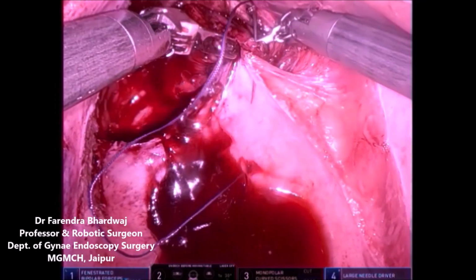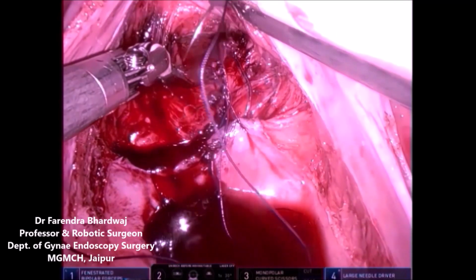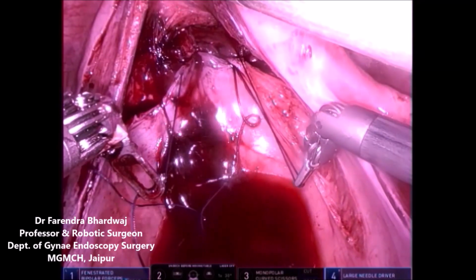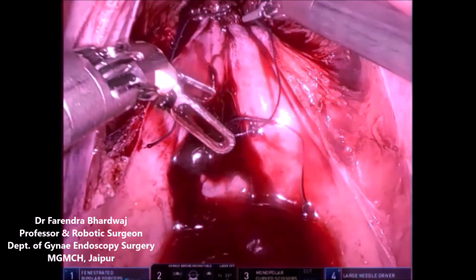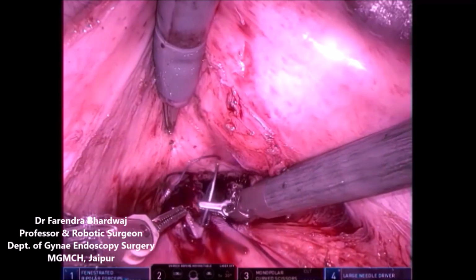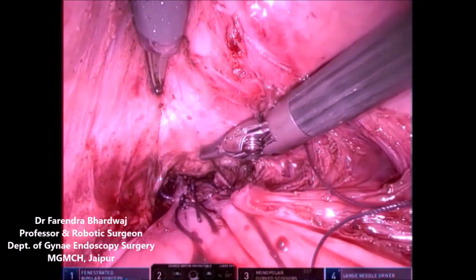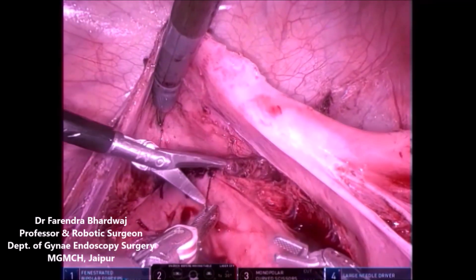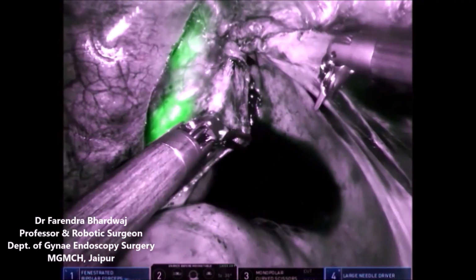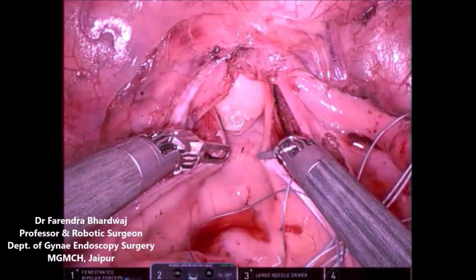Now you can see the beauty of this robotic system and endosuturing with the robot, how beautifully we are suturing the vagina endoscopically in cases of vaginoplasty. Routinely, such suturing, even in laparoscopy, is very difficult, and this is how we have peritonized the posterior vaginal area, and the anastomosis is established between the posterior peritoneum and the posterior margin of mucosa. Anteriorly, the fold of peritoneum is pulled out and sutured externally.